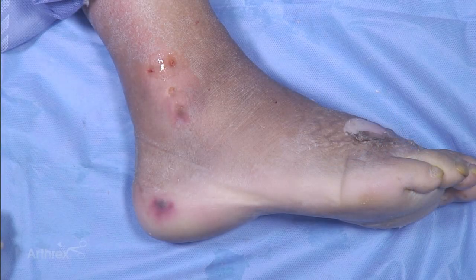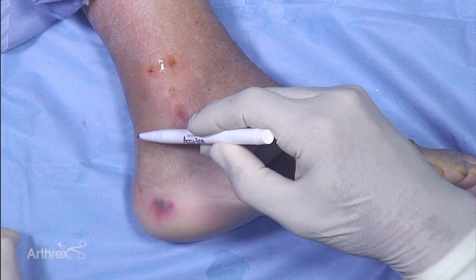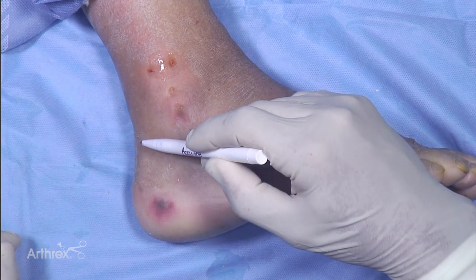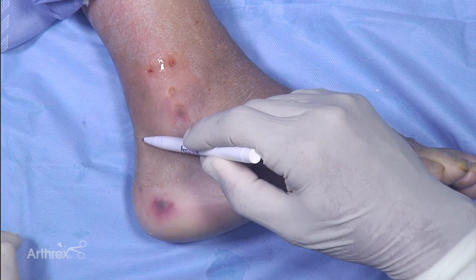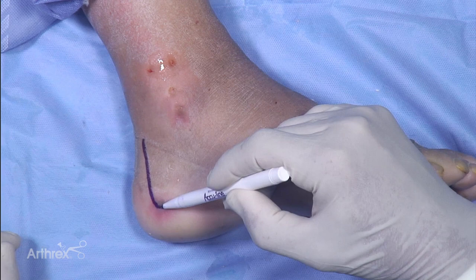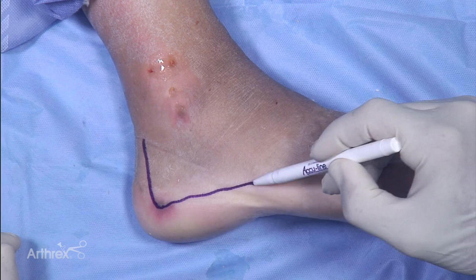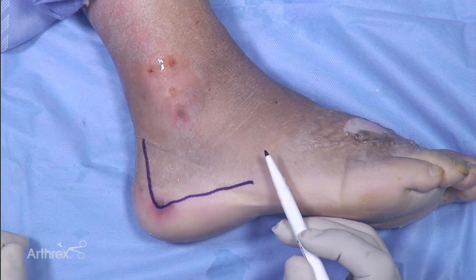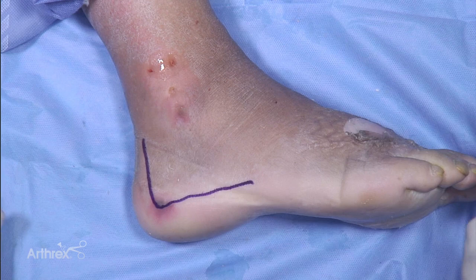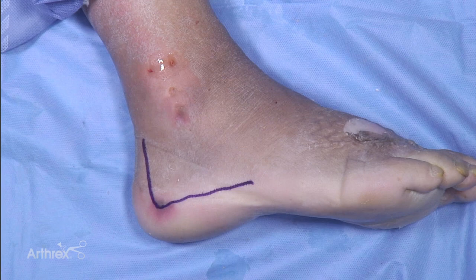There are different ways to expose for a calcaneal fracture. Probably the most common is a hockey stick-shaped incision that parallels the Achilles insertion and then has a plantar horizontal incision that bases up towards approximately the base of the fourth metatarsal. The things you need to worry about more distally are the sural nerve and the peroneal tendons that will come into view.